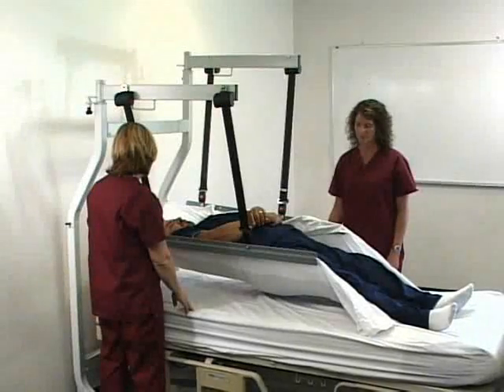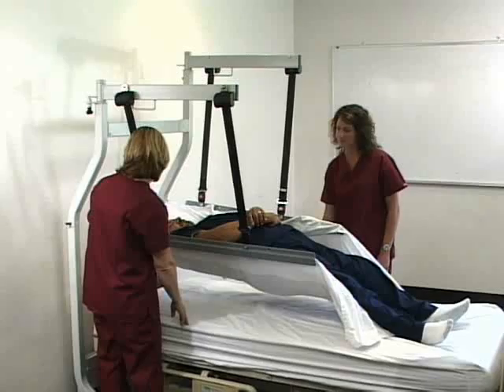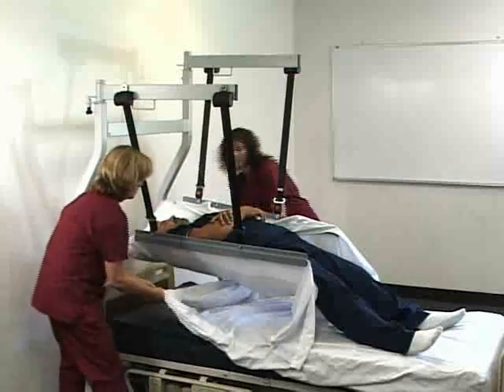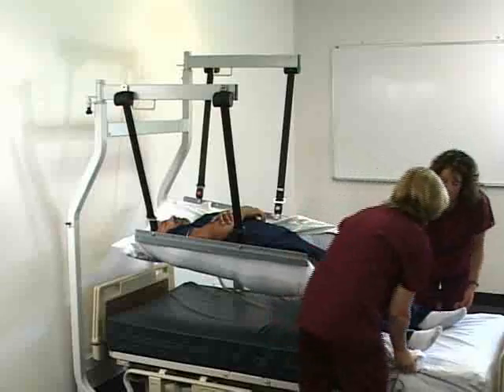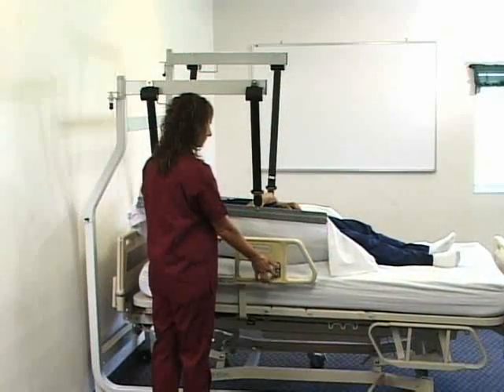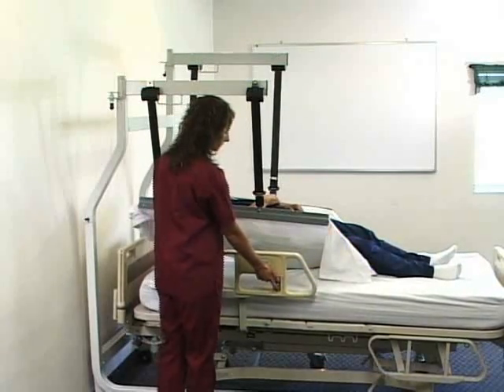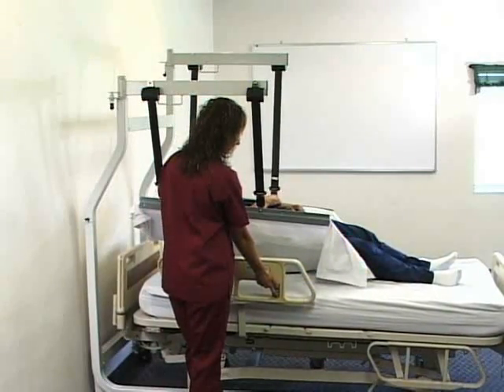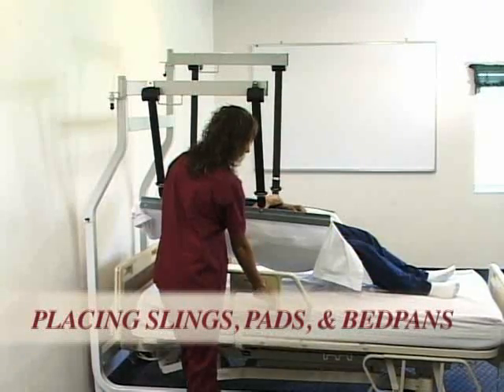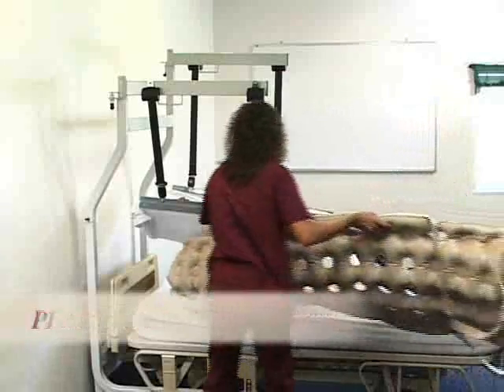Second method. If the linen is not heavily soiled, the patient may be suspended over the mattress. Attach the clamps on each side of the patient, take up the slack, and lower the bed. The linen beneath can be changed quickly since very little weight now rests on the mattress. After clean linen has been placed, the patient can be rolled from side to side to replace the draw sheet. The ErgoNurse lift is designed to suspend patients so they can be placed on a sling or pressure reduction mattress.